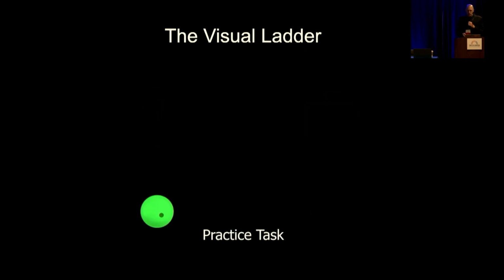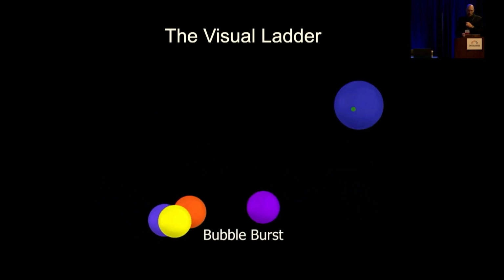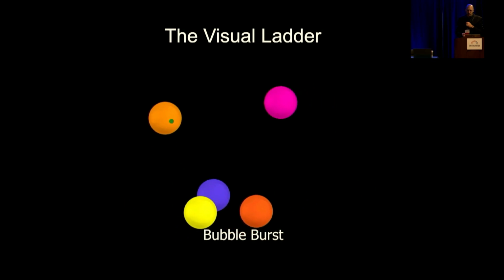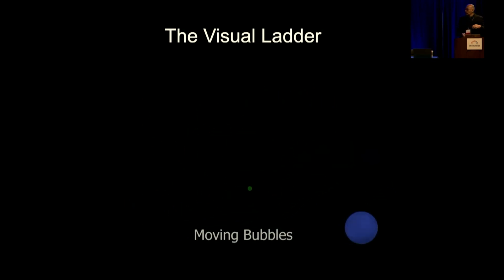You can see as you move your eyes around, you can pop these bubbles. It's a simple little game. Here's a thing called bubble burst. When you put your gaze on it, it'll pop those bubbles. That elicits saccades, and we do this until we get enough saccades to measure it. We do the same thing with tracking, so we can detect smooth tracking and quantify that.